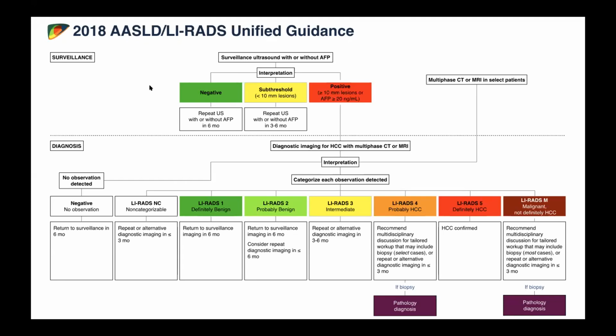So that would be just a T2, a diffusion, and a T1. And the need for these abbreviated protocols has come simply because of the need to shorten the scanning times. However, please do remember, these protocols are not sacrosanct. They are all based on individual-centric or hospital-based practices, and you need to refine them before you take it forward.